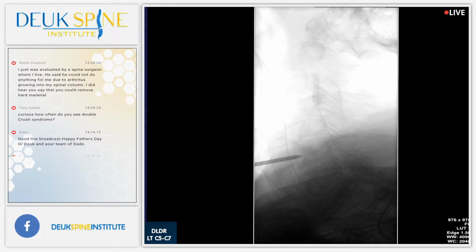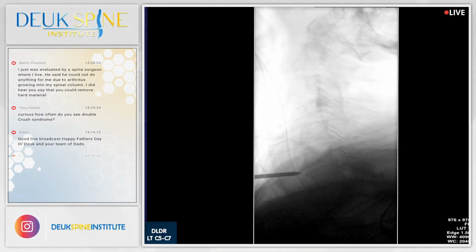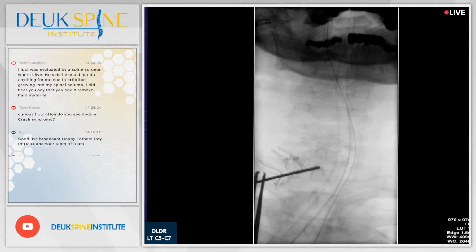Now, I got to climb this little mountain here, like little Mount Vesuvius. Do they have any mountains in Tyler, Texas? All right, perfect. AP, don't move, you guys, don't give up. I need to verify we're in the center. Shot. Yep, perfect. Well, if there's a little mountain in Tyler, Texas, this is it.